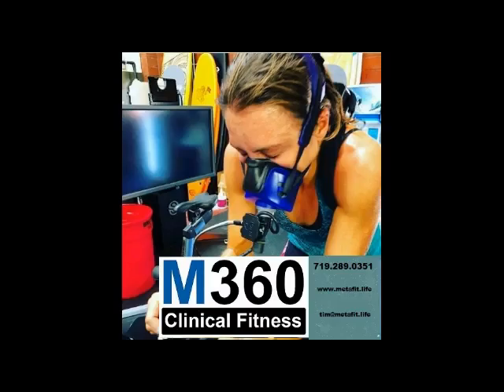Hello, and thanks for clicking in for more information on our CPET cardiopulmonary exercise testing and cardiometabolic crossover. You're going to see two examples, an optimal and a less than optimal.